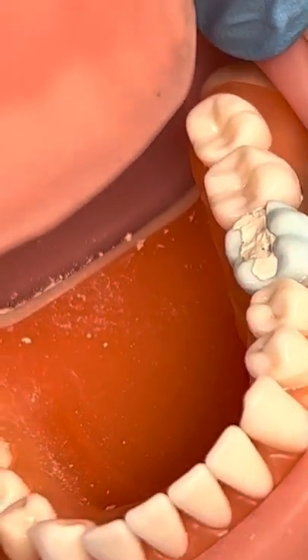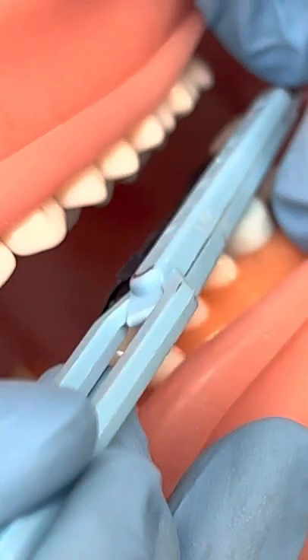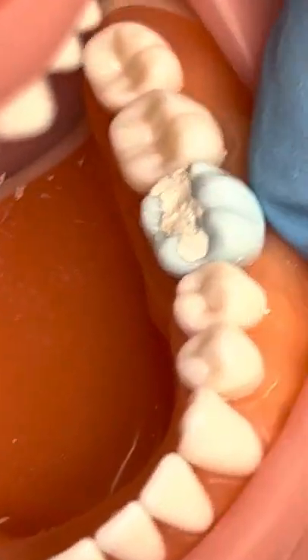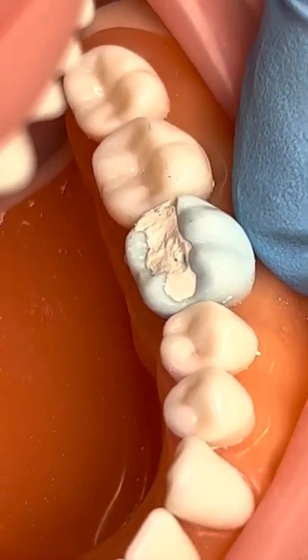You would keep articulating until you don't have any blue marks on your filling material. We'll articulate it again, patient bites down — all right, now we look good. There's our filling.